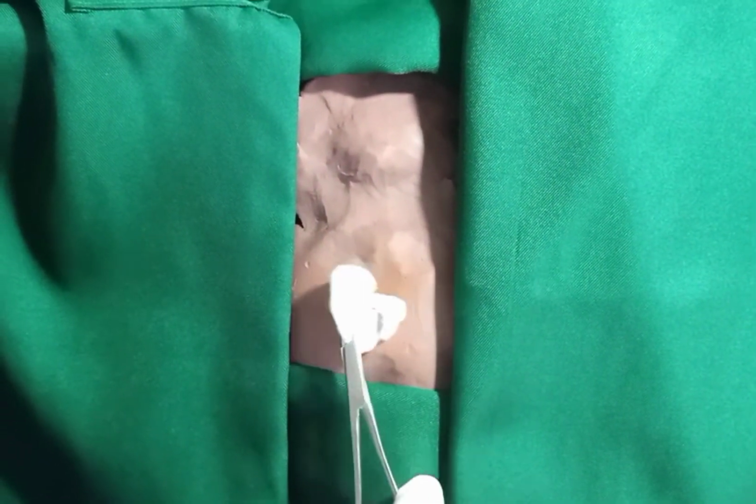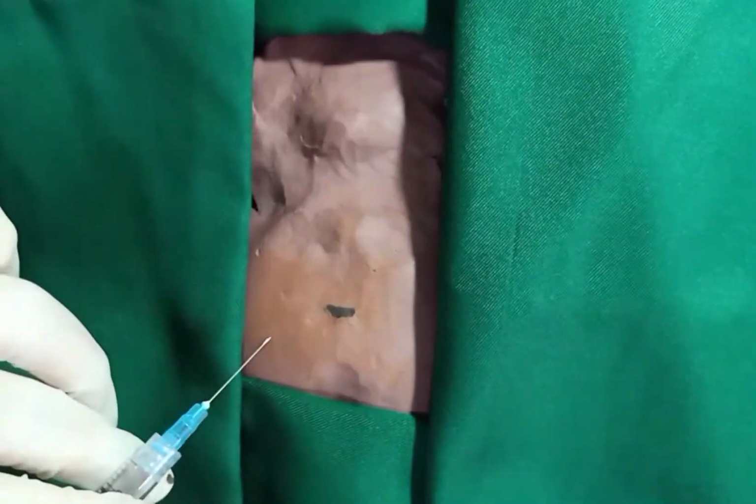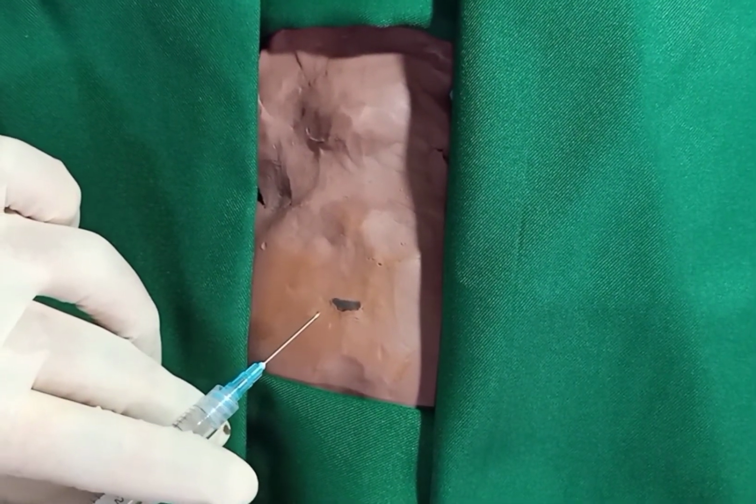Now sterilize the area prior to the incision. Now anesthetize the site with 1% lidocaine.